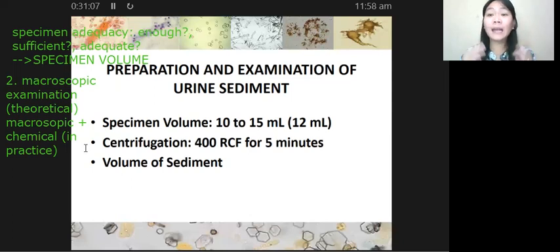Okay, nakuha? Ayan. And apart from that, there are also certain parameters, yes, certain urine characteristics which you need in order to correlate to the possible sediments which may be present in your urine sample. Alright, example, alam ko, nabanggit ito ni Sir Ruben doon sa kanyang video. Example, color. Okay, saan magpo-fall ang color? Macroscopic examination, physical examination. Tama? Ang color niya red. Okay? So ikaw, bilang medical technologist doon sa laboratory, what are sediments that would correlate to a red color? Yes, very good. Red blood cells.